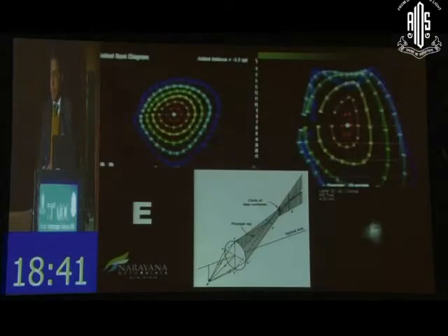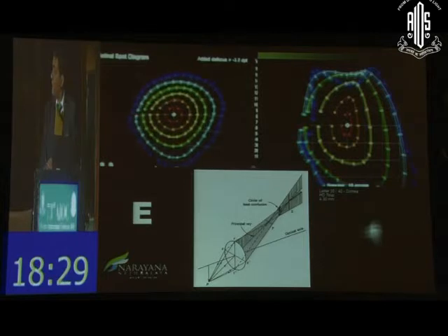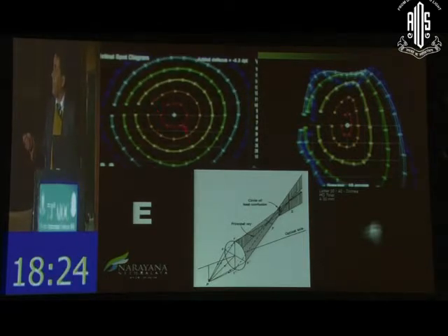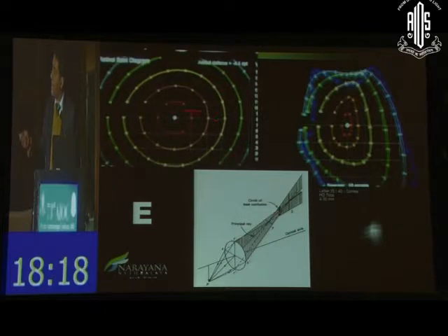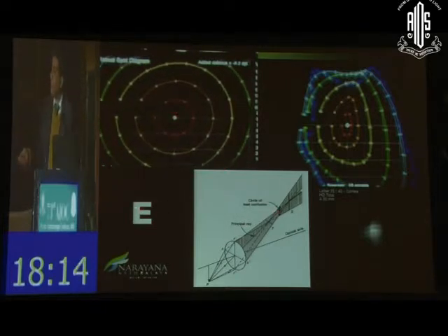And for example, all of us, from our undergraduate days, know about the conoid of Sturm and the circle of least confusion. The question is, today we are able to achieve this on a machine. Most of the aberrometers actually tell you, and this is exactly, if you can look at those 2 images, in a perfect system, these dots of light will form at this point, and you can tell them that this is how the vision of the patient is.